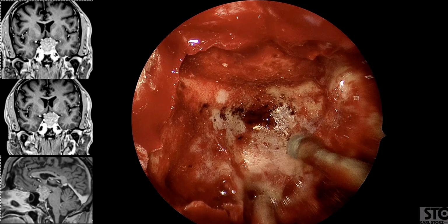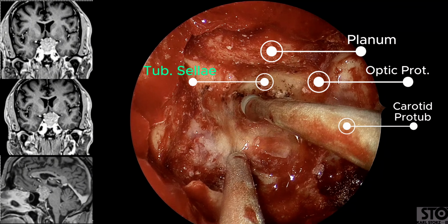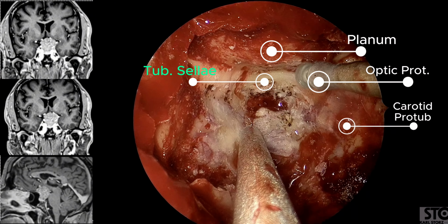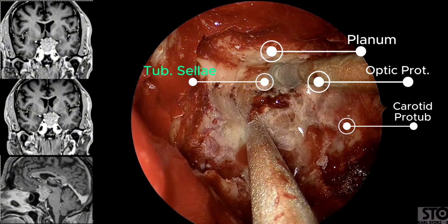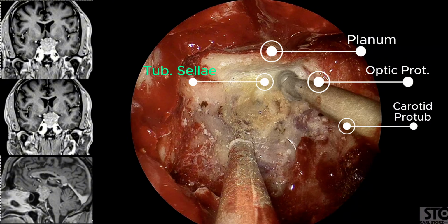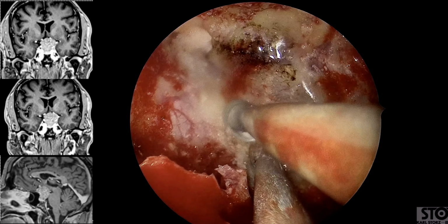We proceed with progressive bony removal, starting at the superior aspect of the sella, followed by the limbus sphenoidale and tuberculum sellae. Drilling is extended anteriorly over the planum, creating a trapezoidal window, typically 2 to 3 centimeters from anterior to posterior over the planum. Exposure is often required to access the suprasellar component. The exposure is then extended laterally to skeletonize both carotid arteries.